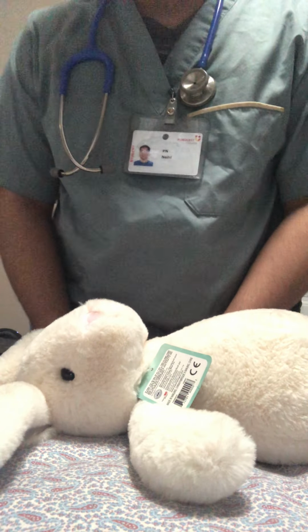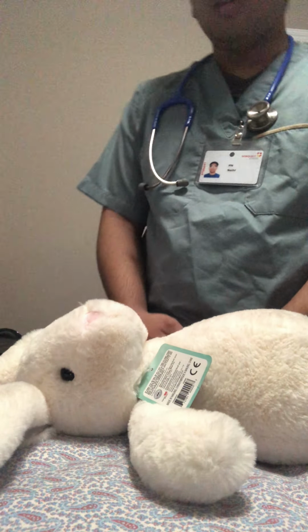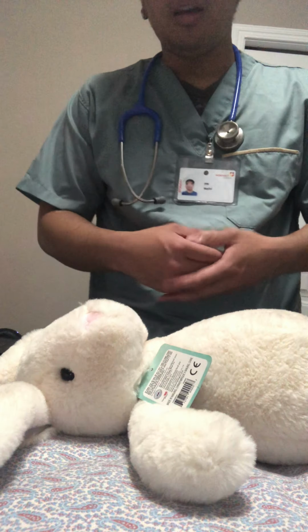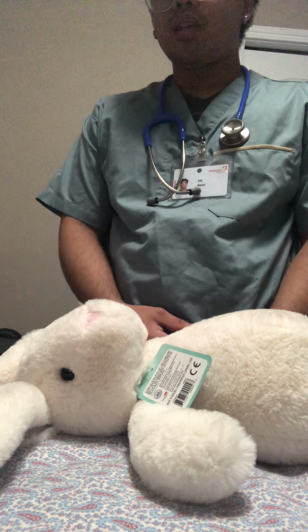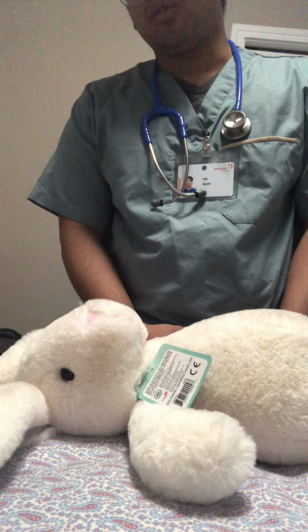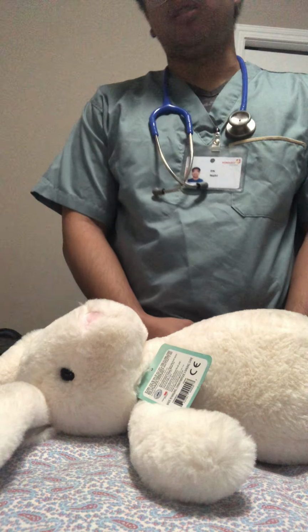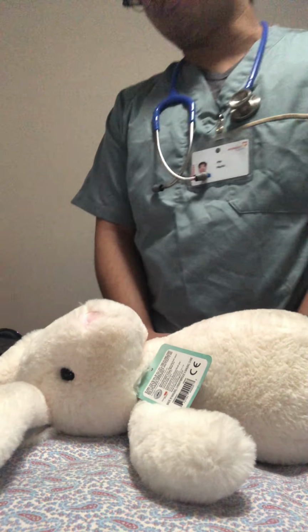So for his vital signs, we'll be doing his pulse rate, respiration, blood pressure, temperature, and O2 sat. Let's say for his pulse, he got 64 beats per minute. It's within the normal range of 60 to 100 beats per minute. For his respiration, he got 13 breaths per minute, which is within the normal range of 12 to 20 breaths per minute. His temperature is 37.5, which is within the normal range of 35.5 to 38 degrees Celsius. As for his O2 sat, it is 98%, which is within the normal range of 95 to 100%.